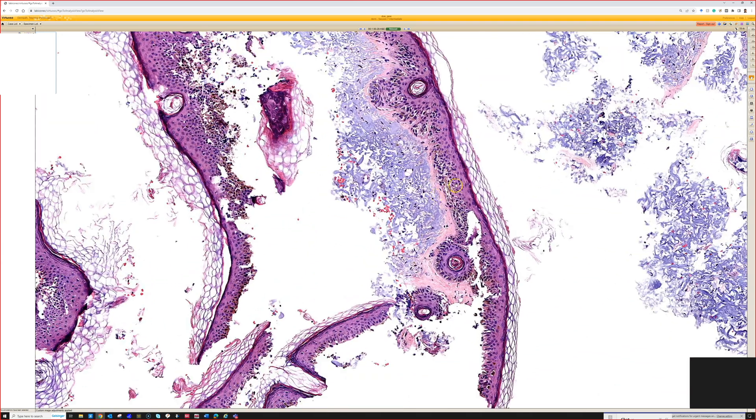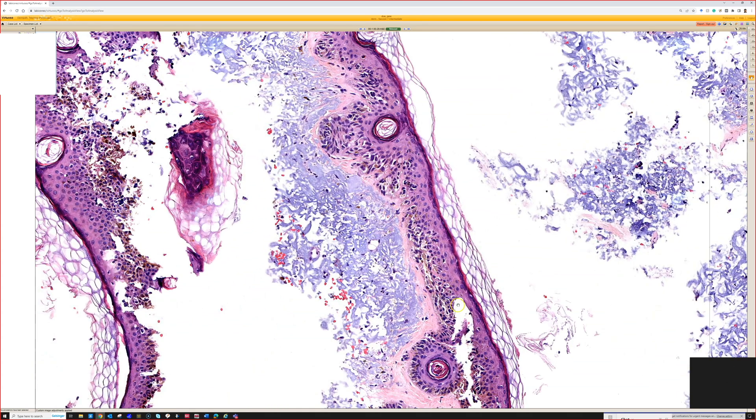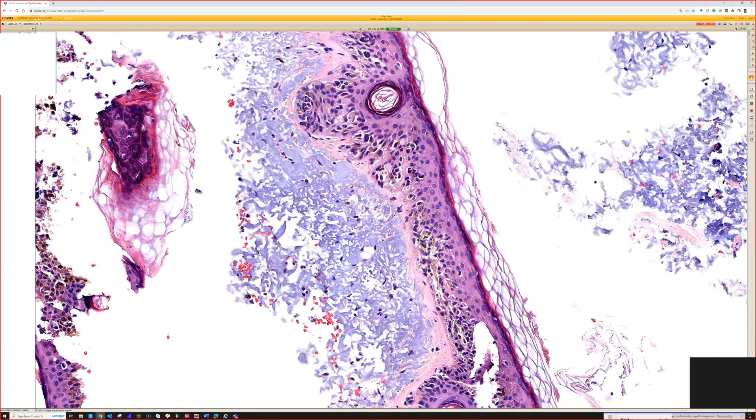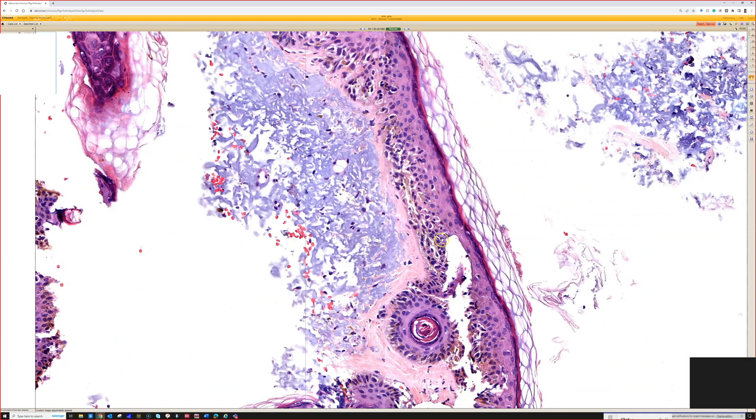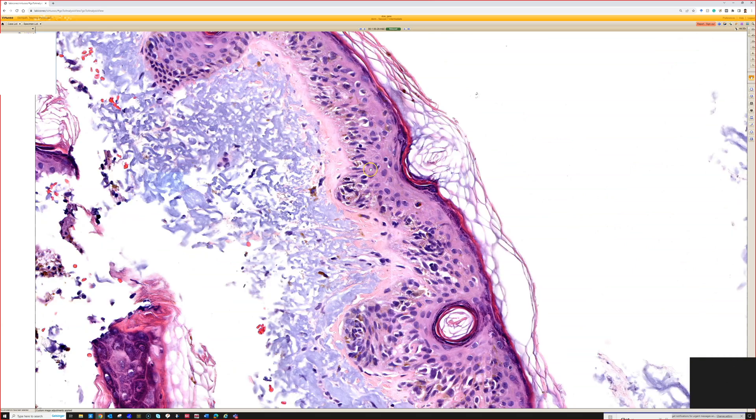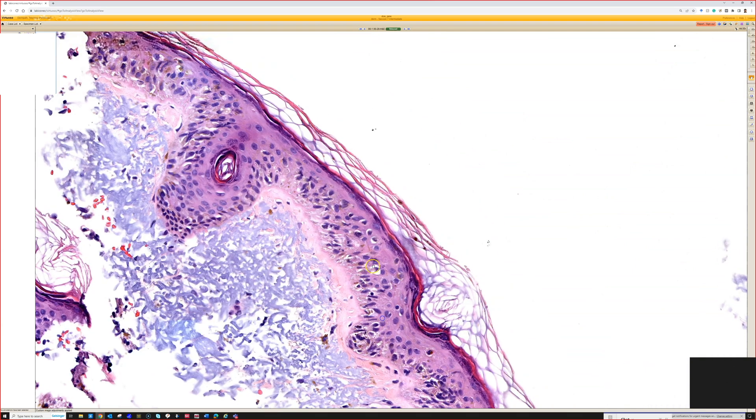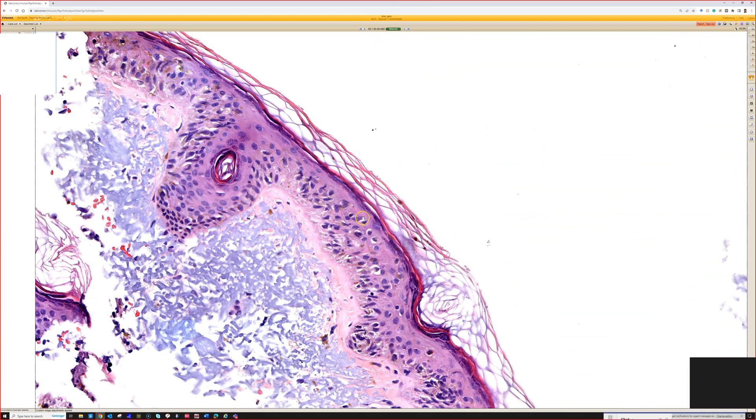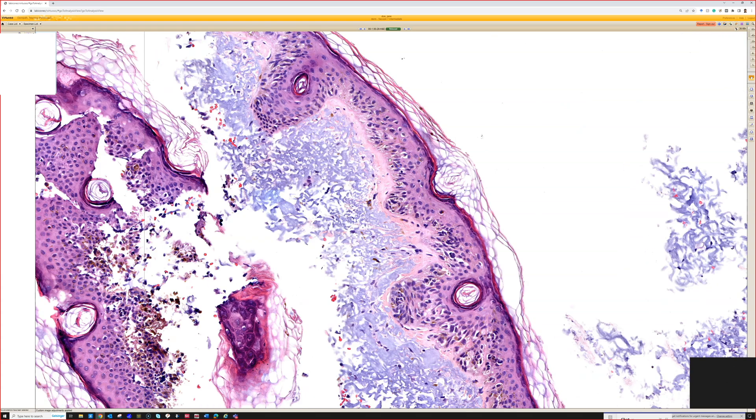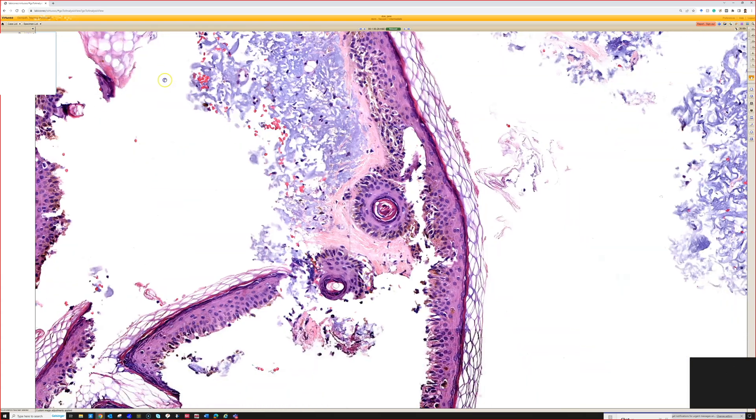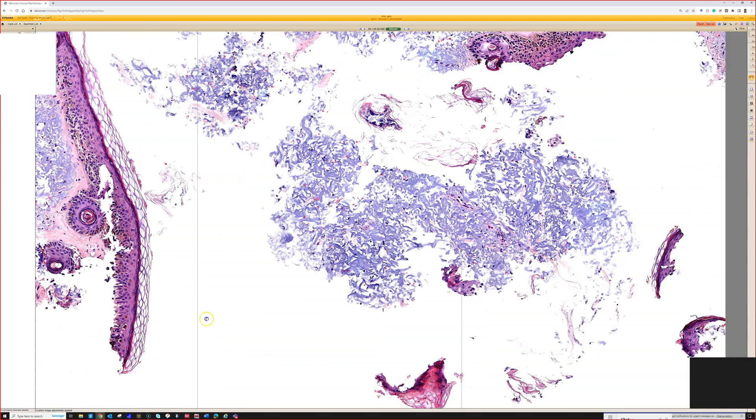This was melanoma. This is lentigo malignant melanoma where you can see confluent growth. This is actually a pretty good example of confluence: atypical melanocytes replacing the basal layer as single cells and there are nests in some areas. There's pagetoid spread here. Lentigo malignant sometimes don't have pagetoid spread, sometimes they have none, sometimes they have some. It just depends on the case.